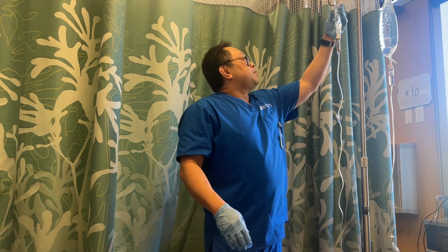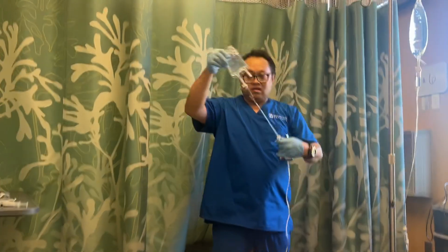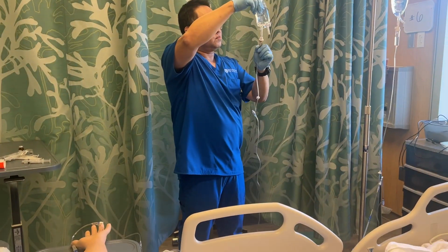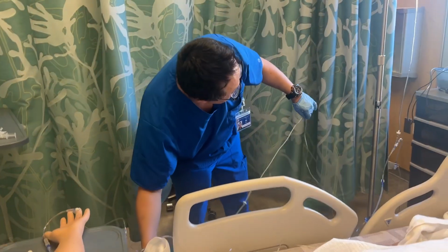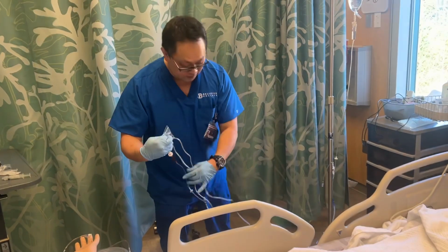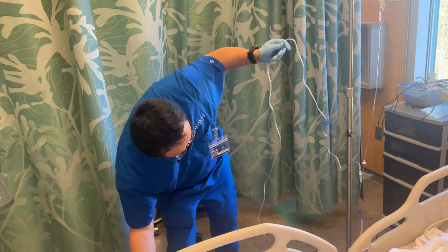Okay, so now I'm going to back prime this. And squeeze the chamber halfway also, like the other one. Okay, now I'm going to back prime it. And again, making sure there's no air bubbles for this one also, just like the primary.